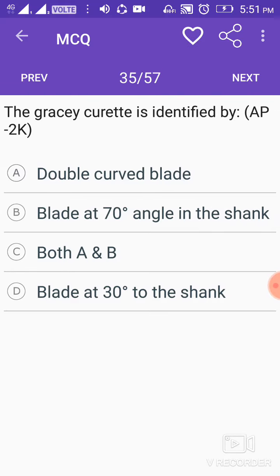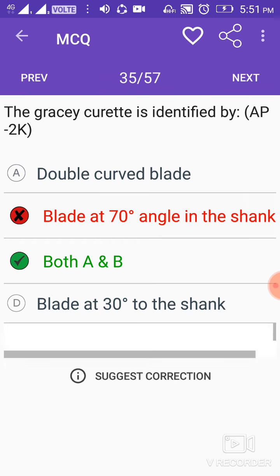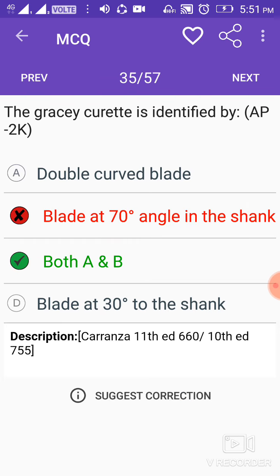The Gracey curette is identified by a double-curved blade and blade at a 70-degree angle to the shank.